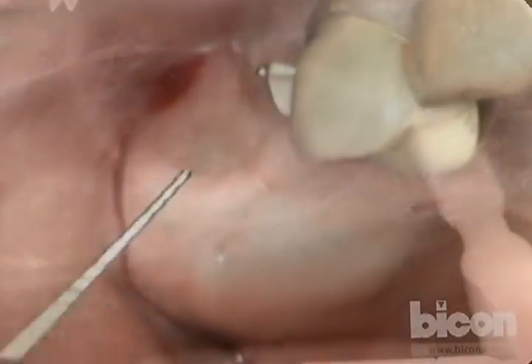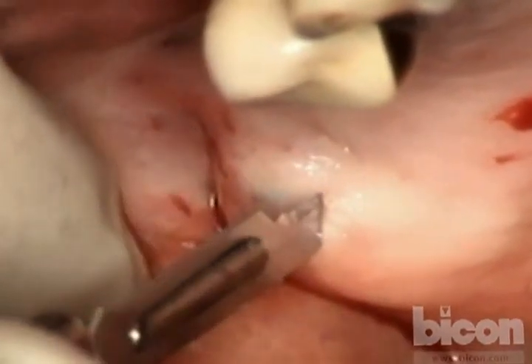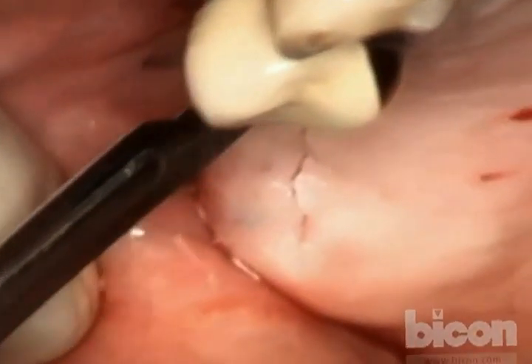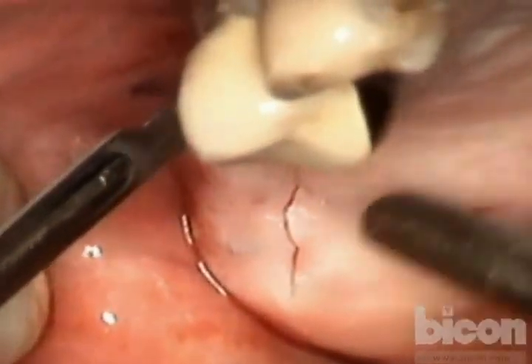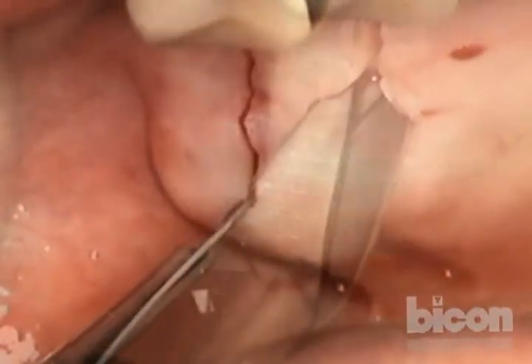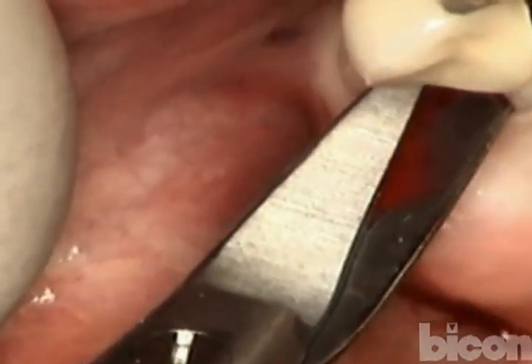The question now, if you can hear me, is whether the little scar in the center of the crest is going to allow us to bridge that gap, or do we have to make the incision right through it? All right, now, before I go on too far, we'll open it up. Don't suction all the red stuff, I need it. And we're going to collect some of the patient's own blood to use in the graft.